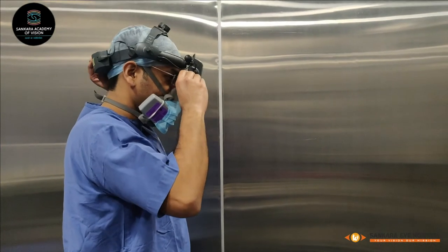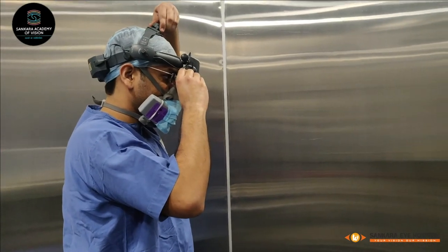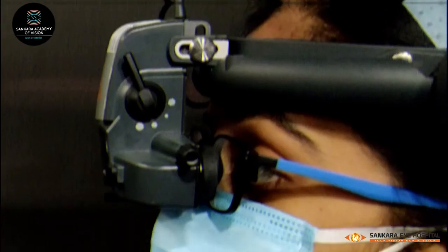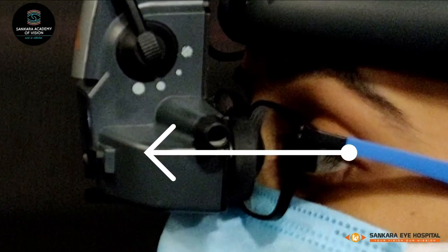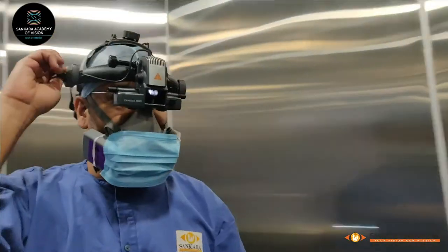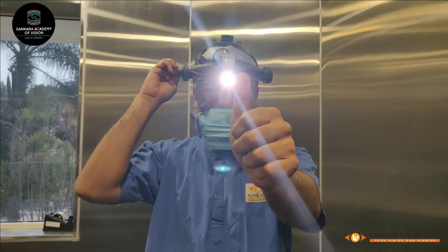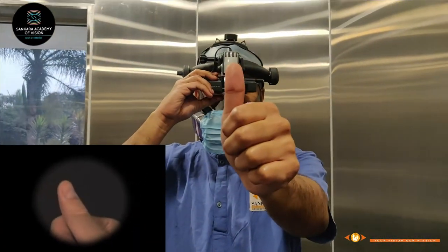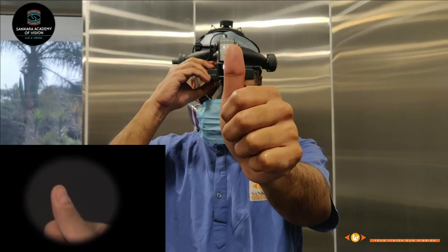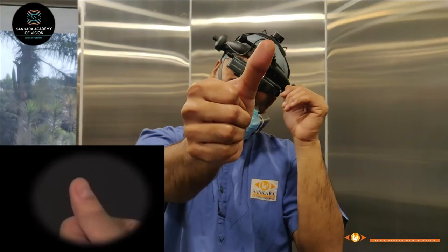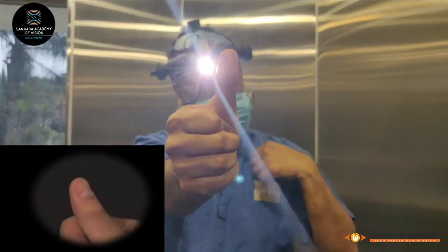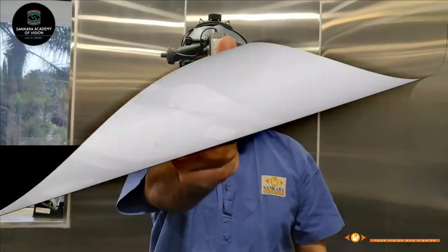Adjust the headband so that the scope is secure on your head. Eyepieces should be as close to the pupil as possible and perpendicular to the pupillary axis. Switch on the light source. Adjust your interpupillary distance and make sure the light spot is well centered from both oculars at arm's distance. Move your head sideways and check that your finger is still in the visual field.